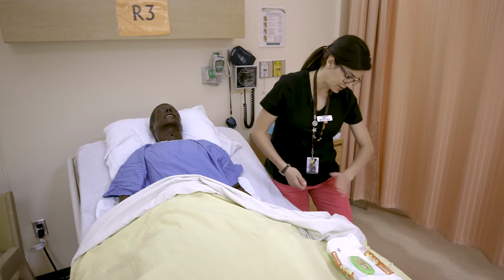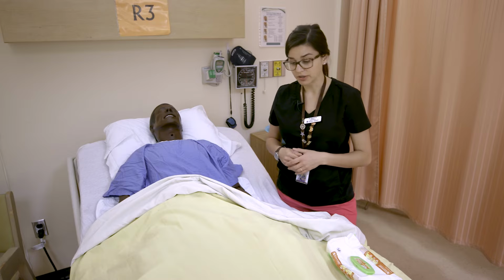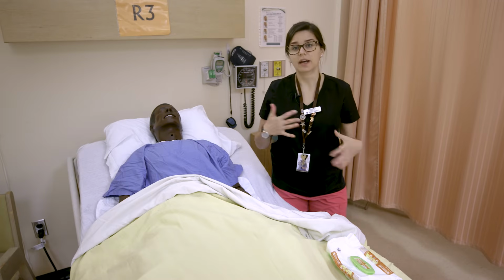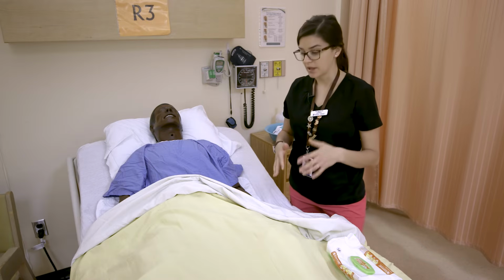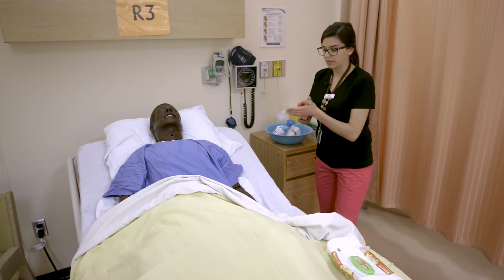And when you kind of get under the bed and look, you'll see there are some areas where you can attach it to. You also want to make sure that you're emptying the foley and recording at least every 8 hours, or if needed, a little bit more often. So we're going to get started and we're going to do some peri-care around the foley.